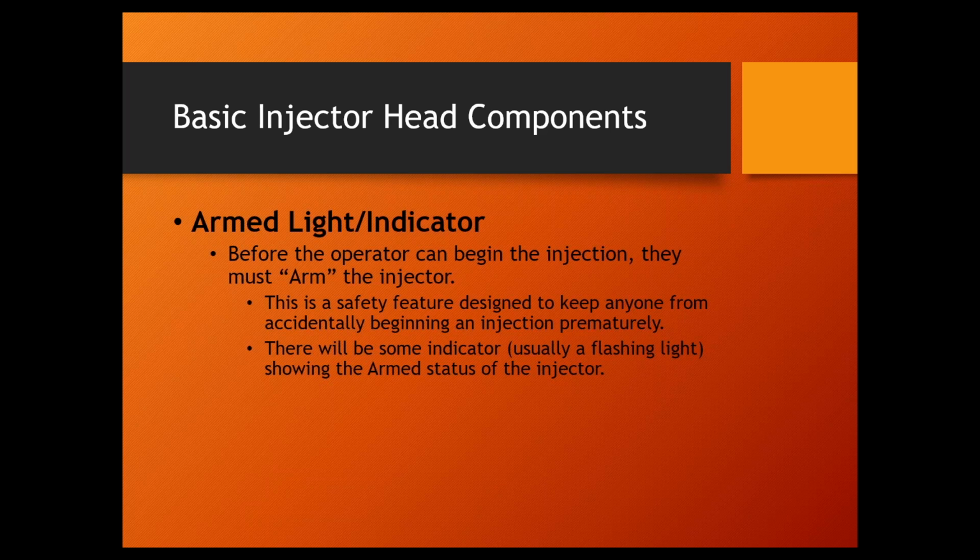For these, if you're going to make an air detector, you want to make it super sensitive so you don't miss anything. You can't let one get by every now and again. The air detector has to be super sensitive, and even with infusion pumps, there are false alerts. It's one thing when it's an infusion pump. No big deal, no harm, no foul. The problem is with these, if you get a false air detection, then we have to start this whole thing over.